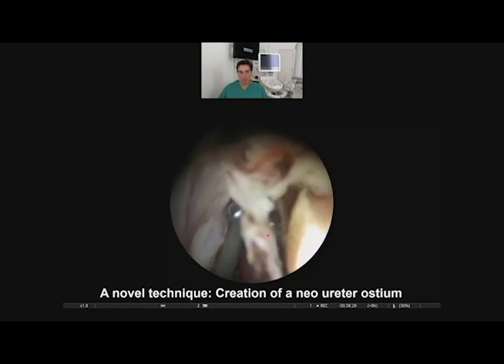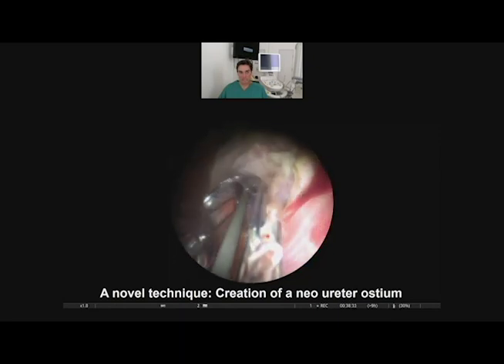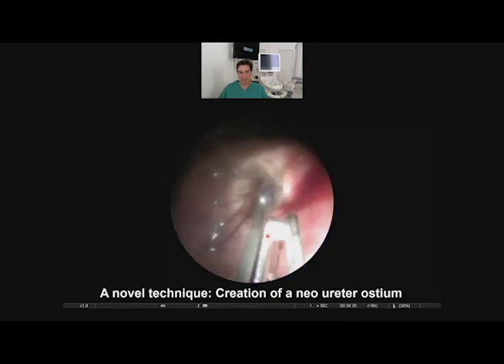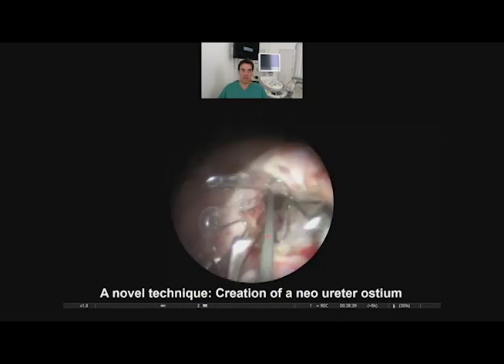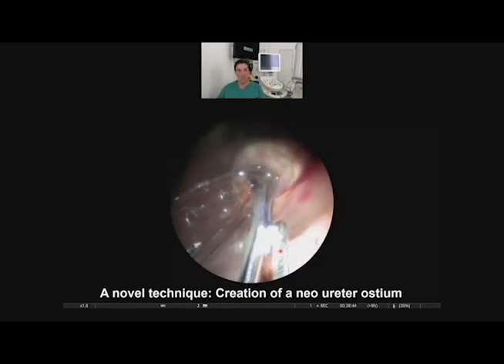I bring it a little back. And that's why I show it to you. You can put the stent a little in that position, but you can't bring it higher. So start higher, and you see it here. It looks nice. It is inside. All is okay.